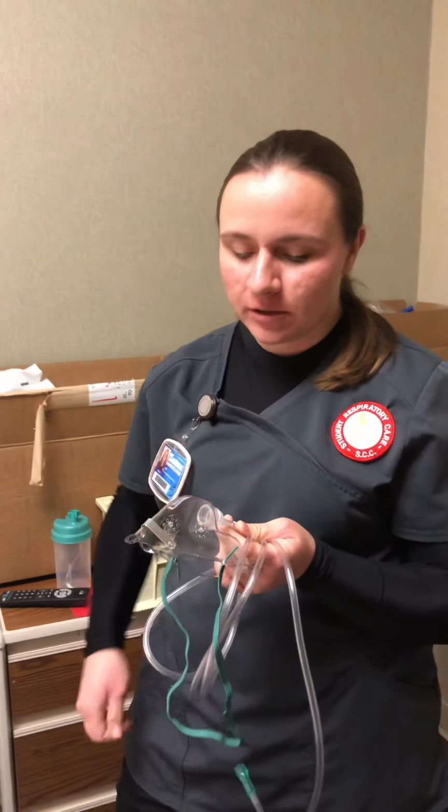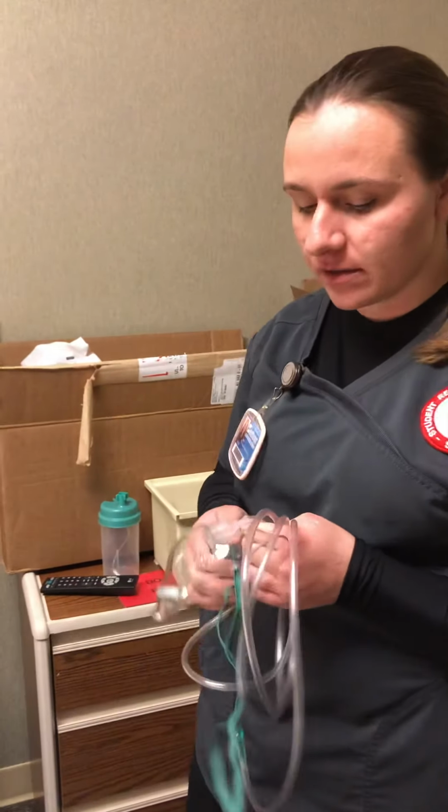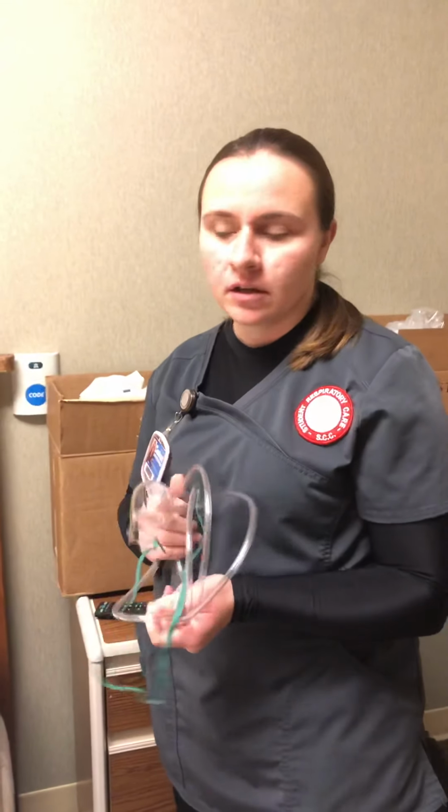Alright, good morning. I'm going to do an O2 scenario. So the doctor has ordered a simple mask. The patient came into the ER and they would like them to be at 5 liters per minute with this simple mask. So I'm always going to check the patient's chart even before I enter the room to make sure I catch any major details that I may need to know about the patient before I enter the room.